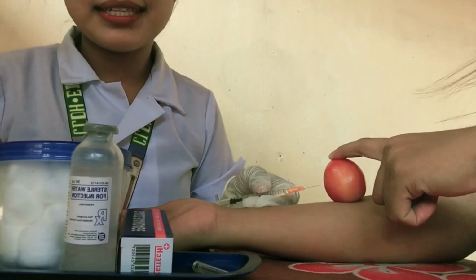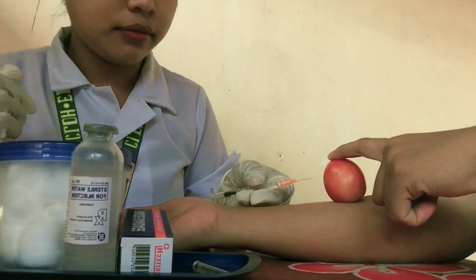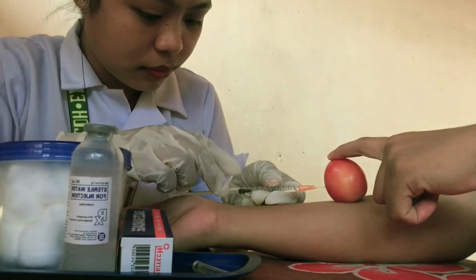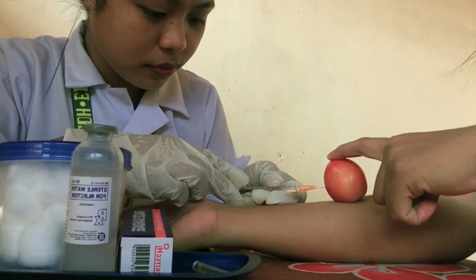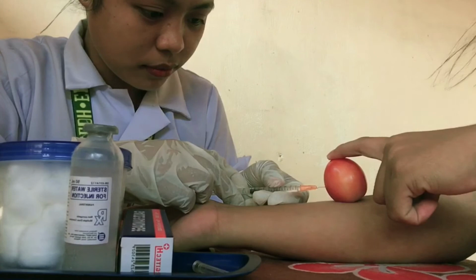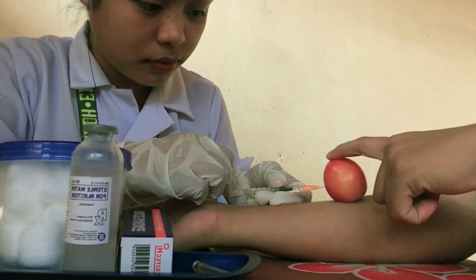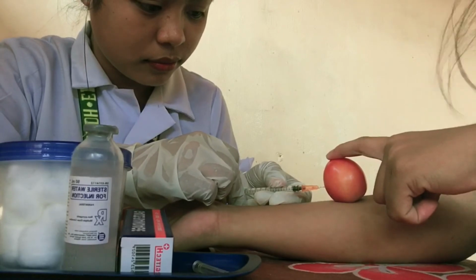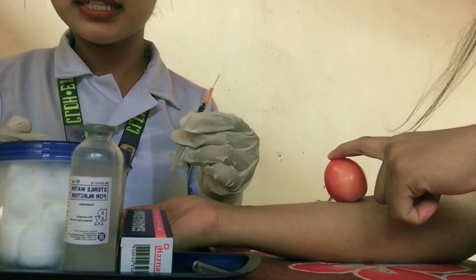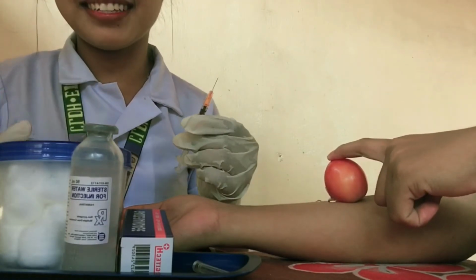After that, I need to stabilize the needle and inject the medication slowly and carefully. After that, we need to discard the syringe in the right disposal.